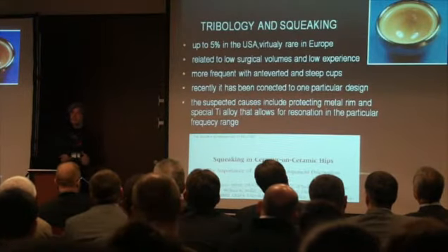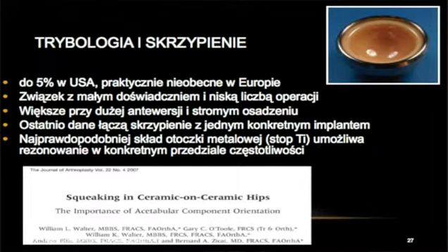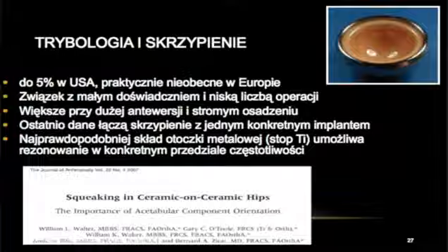Squeaking. Squeaking is of course a tribology-related phenomena. It's caused by dry contact and edge loading. And the problem is that it is mainly in the US, because in the States, surgeons are much more inexperienced than in Europe, and that's why they place sockets in very poor positions.